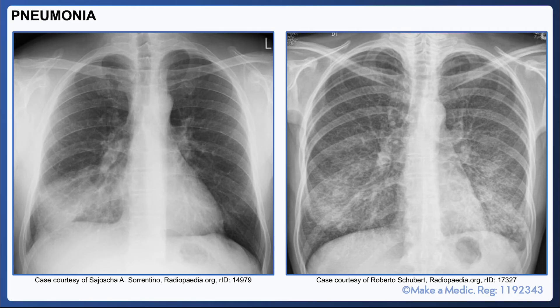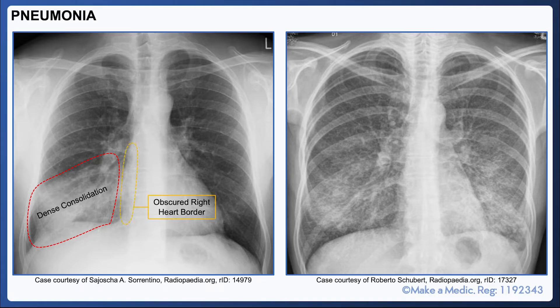Pneumonia refers to an infection within the lungs where the air spaces become filled with fluid or pus. Sometimes you'll be able to see dense consolidation in a specific area of the lungs. In the case on the left, you can see dense consolidation in the right lower zone with obscuring of the right heart border.